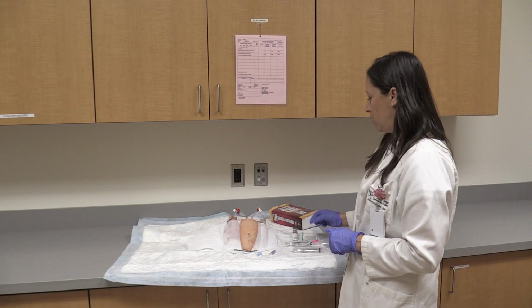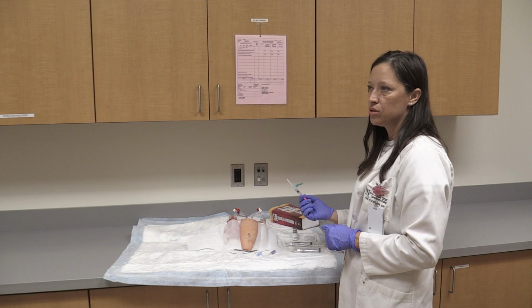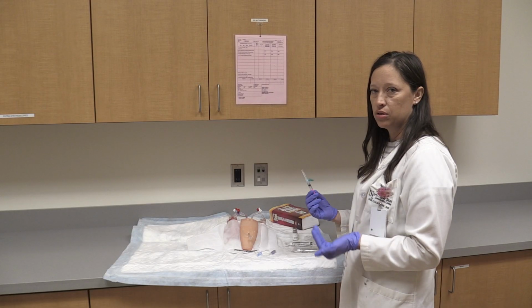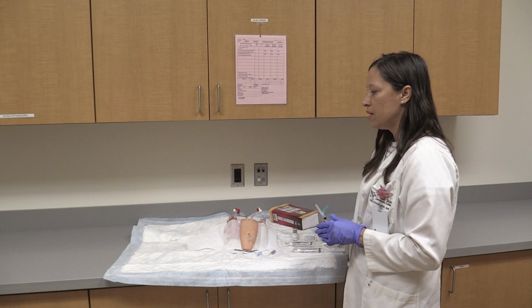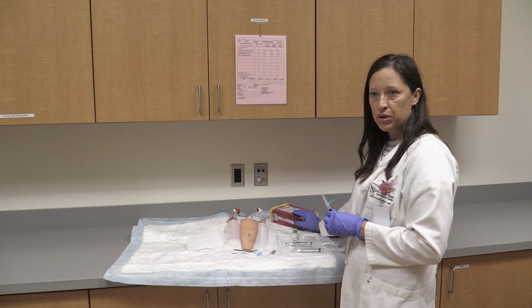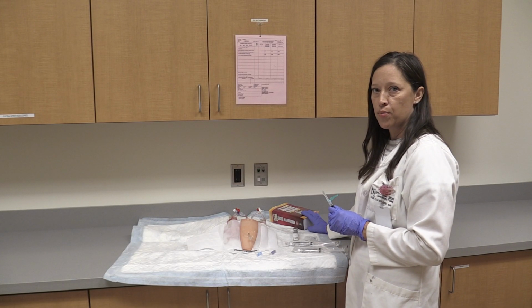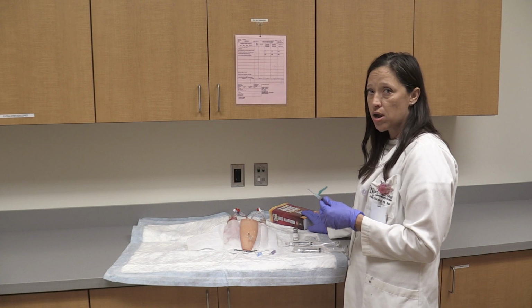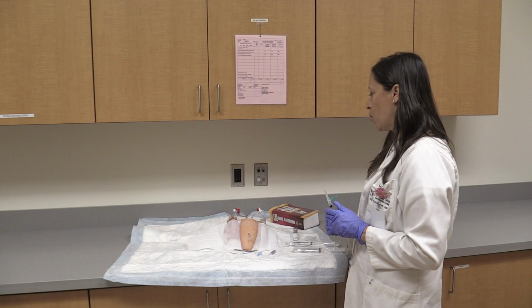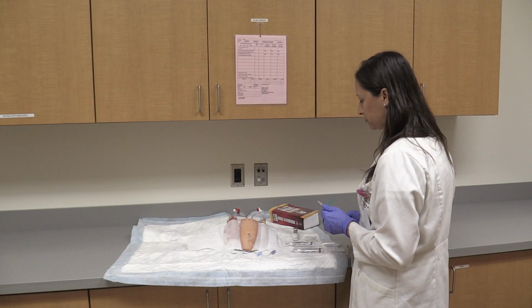One thing with IV medications is different medications are meant to be delivered at a different rate. Some can be delivered quick, some have to be delivered slowly. So if I've never given morphine before and I don't know how fast to give this, I need to look up the information in this drug book. The general rule for morphine is 1 milligram a minute. So since I'm giving 2 milligrams, then I'm just going to give this slow IV over 2 minutes. So always make sure you know how fast or how slow to give any medication.